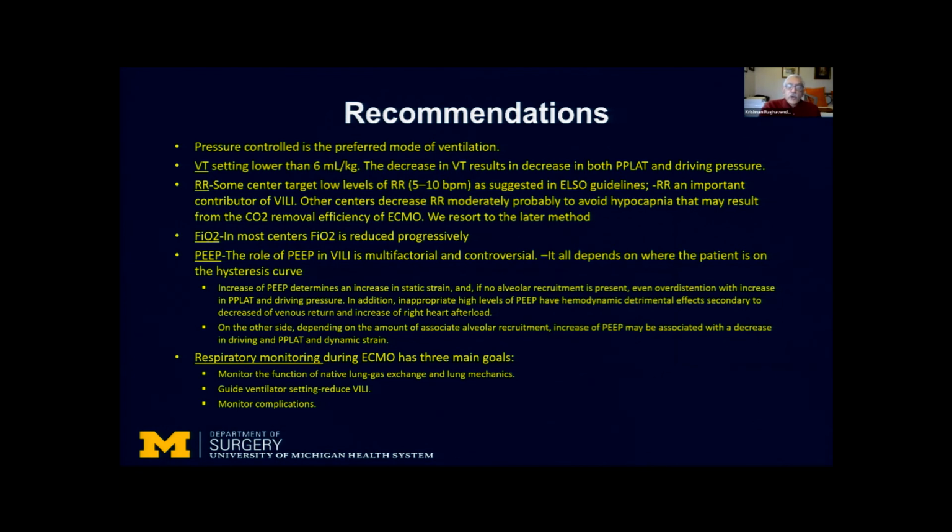So continuing on the recommendations, once the patient is placed on ECMO for respiratory failure, we prefer pressure control mode. As you know, the flow is much higher with the pressure control mode compared to volume ventilators. We also have the ability to raise the I time so that we can appropriately address oxygenation deficits. We will keep the tidal volume lower than 6 ml. We try not to go as low as 3 cc's, but we do that by decreasing both the plateau pressure and driving pressure.